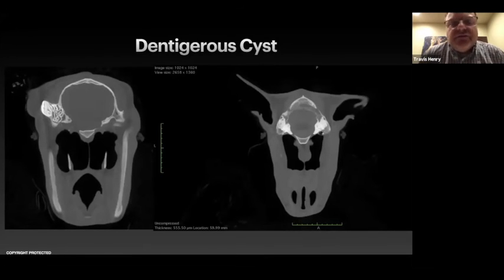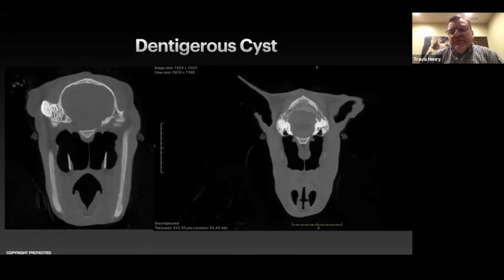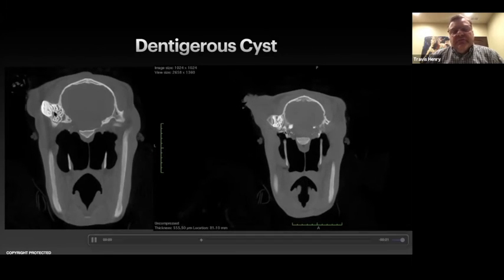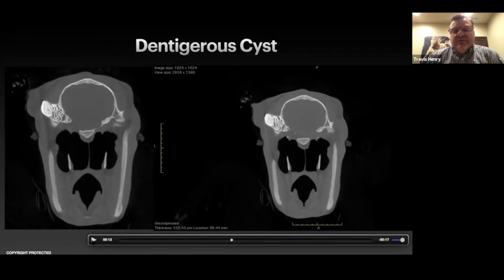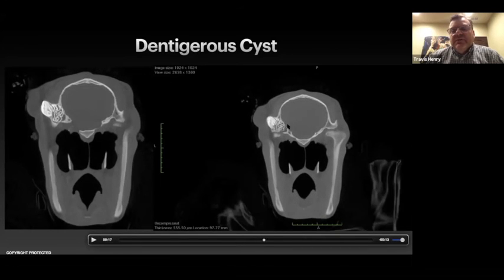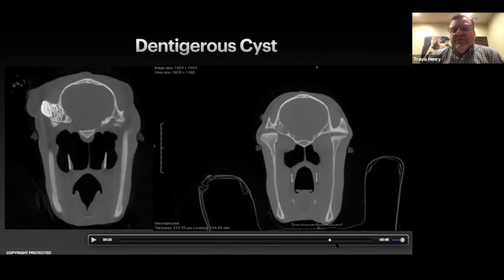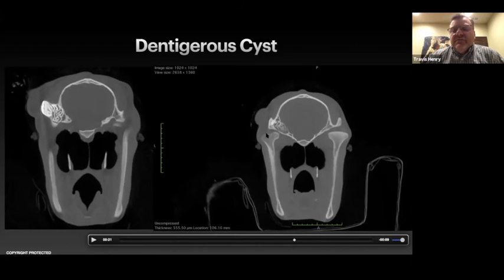Talk briefly about dentigerous cysts and the importance of CT here. The last two cases we've had of these have ended up being euthanized due to there being teeth that actually were communicating with the brain vault. So we can look at this cross-sectional video here. For one thing, on radiographs, we were convinced there was kind of one big tooth, and what there actually was here is two teeth laying horizontal. And when we scroll back through this, you can see that we lose the bone in the calvarium here, and it's actually into the brain vault. And if we move forward, you can actually see that the petrous temporal bone is very thinned by this and how closely that is coming to communicating with the temporomandibular joint.